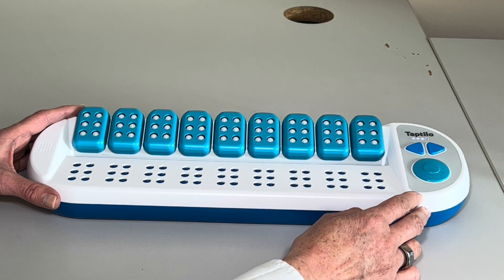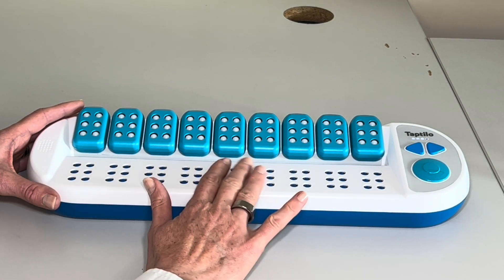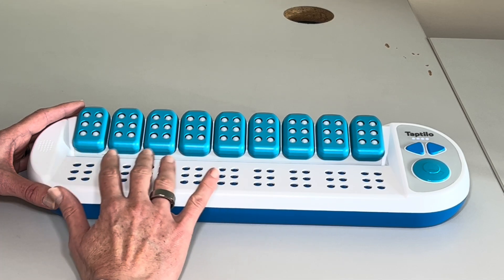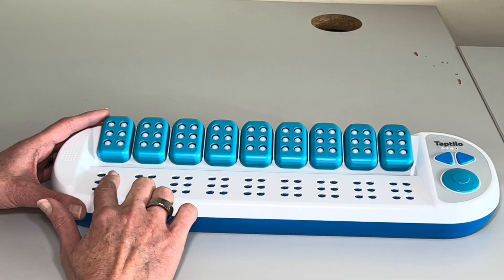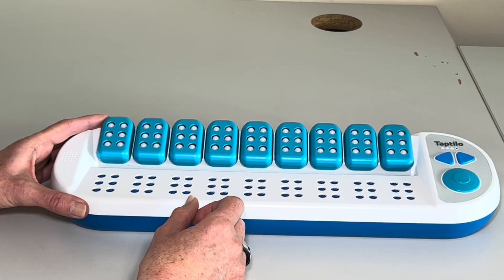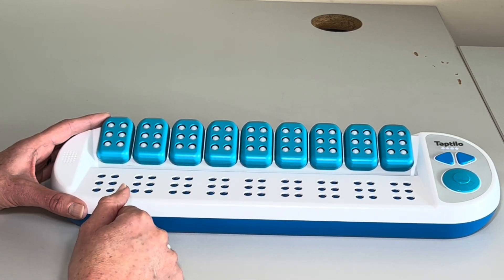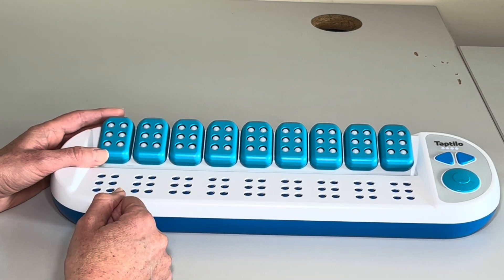There are different modes and activities that you can do. Read will be just to have a word on the output here, just for you to get used to the shapes and have that word read to you. Or we can do trace and write, which will give us a word on the output and we can make the braille symbols above it. There's also dictation, where it will read out a word and we match that word to see if we've got it right. And then there's write as well, where we can just make up a word, put it on the input cells, and the TapTilo will read it back to us.